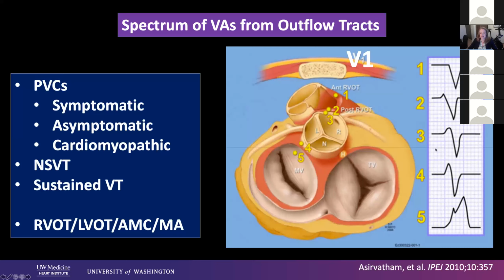So it tells us a lot. If you're in the anterior RVOT, you are essentially right under lead V1. You are between the substernal space and the actual physical lead V1. So there's not going to be any deflection towards yourself.